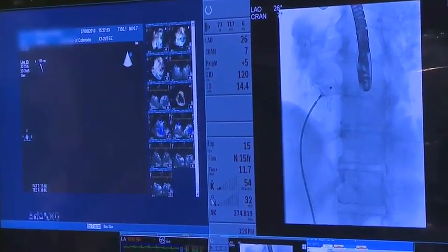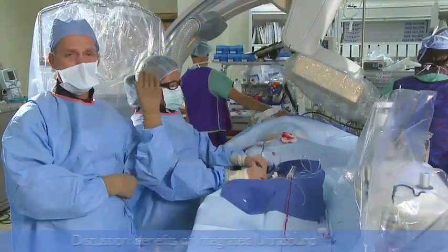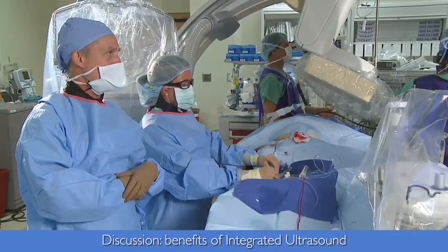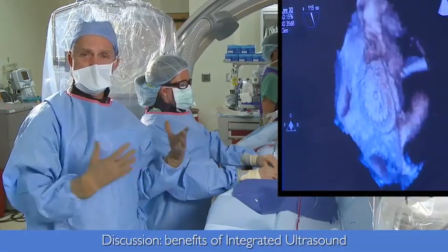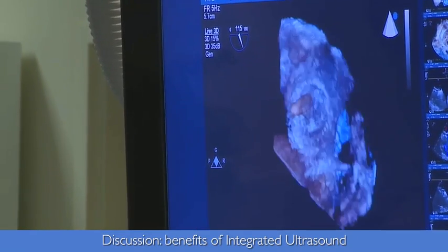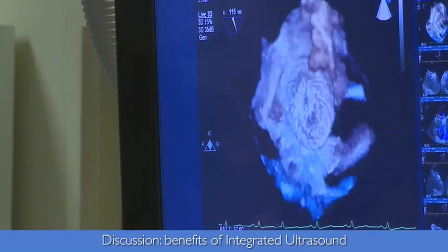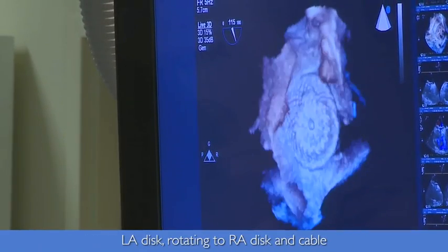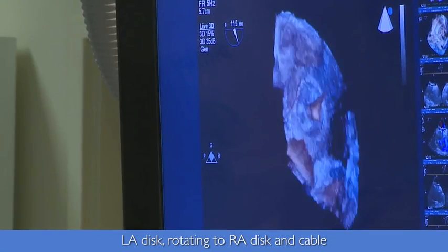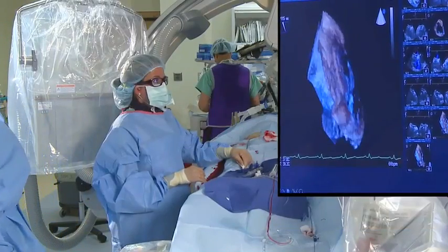So this is just great seeing these large ultrasound images. It really allows us to understand, as well as the echocardiographer, whether we've got the correct device placement, whether we chose the right size, whether we see any interference with contiguous structures. And you can see he's looking at it from, here's a nice view of the left atrial disc, and then he can rotate and show us the right atrial disc, and you see that bright line coming in, that's the cable.